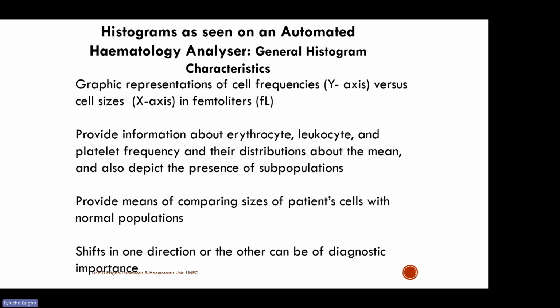Okay. Another thing that is important, apart from you being able to describe the clinical implication of every abnormality in every cell, is that you should also be able to evaluate the output from a hematological analyzer, looking at the graph the machine produced, and that will be your assignment.